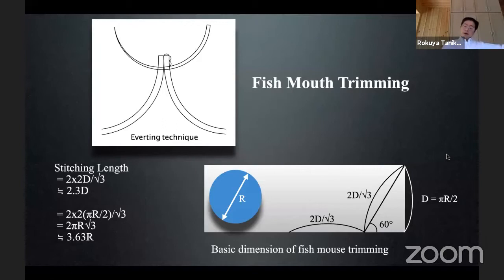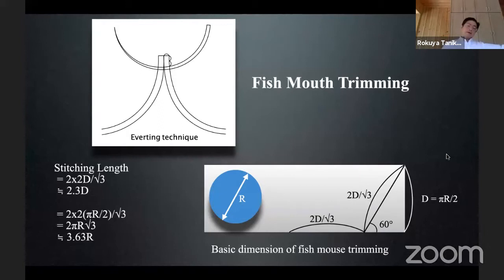The same thing can be said in micro-anastomosis. This is the everting technique of donor and recipient vessel wall — the intima must face each other. Then you can penetrate both vessel walls easily. This is the everting technique.